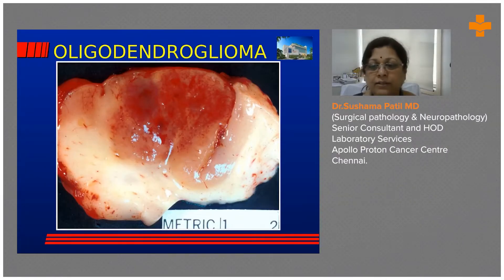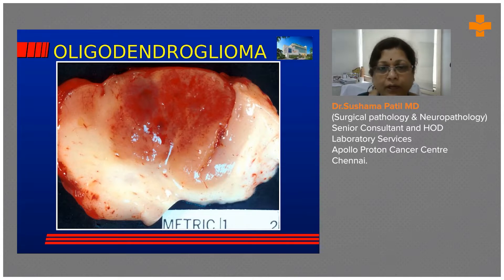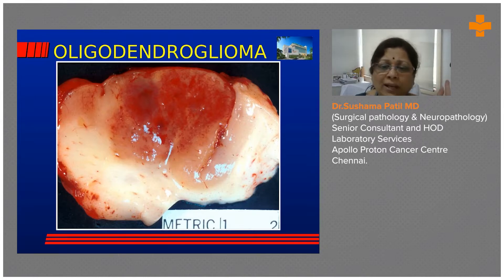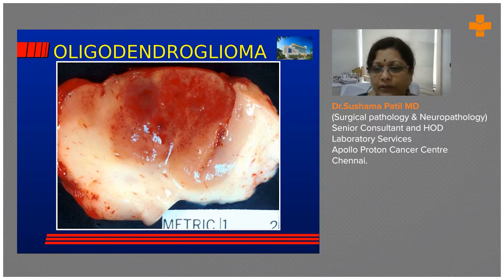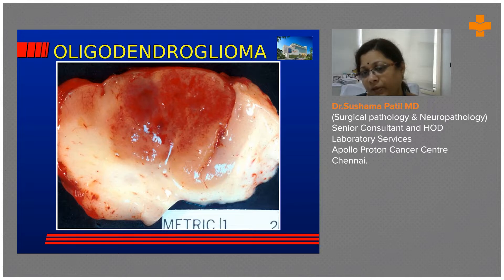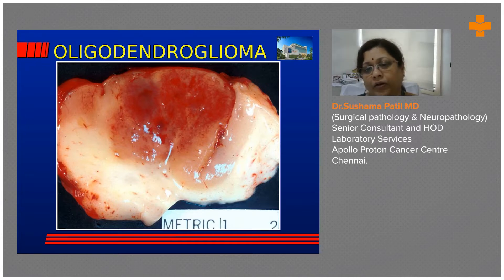Moving on to the oligodendroglioma — after pylocytic and the low-grade and high-grade gliomas. This is an oligodendroglioma; this is a gross tumor section. You can see how vascular and red the tumor is. It is so close to the cortex — on the right aspect of the image you can see the gray-white junction is still retained, but in the tumor area it is completely gone.